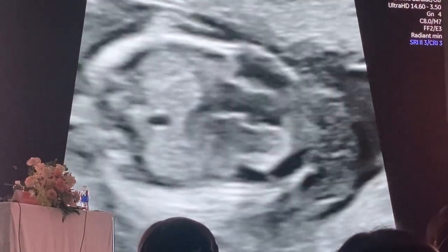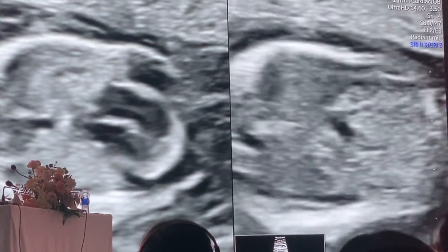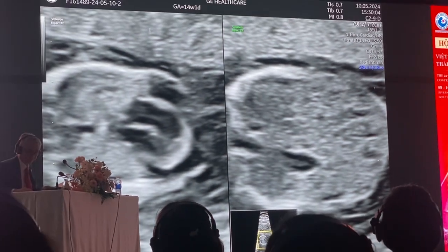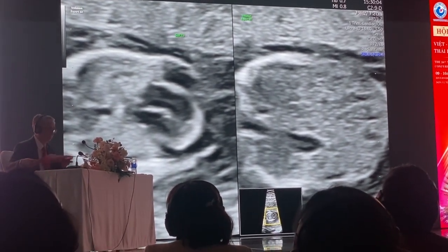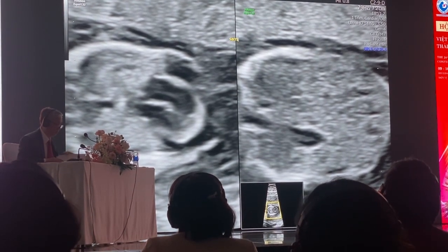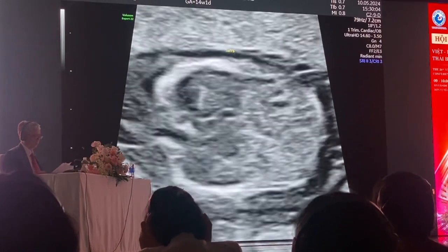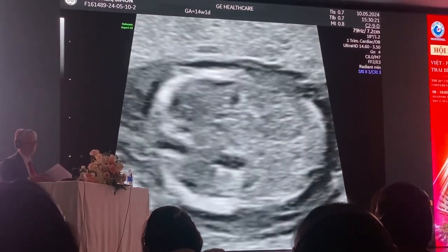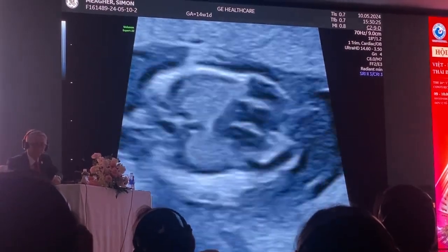And I look at the size of the left and the right cardiac ventricle. And I split the image in 2. I confirm that the stomach is on the left-hand side, and now I do size, axis, rate, rhythm, and situs. So I do SARS. So I then save that image to the screen, and then go back to a 4-chamber view. And once I'm in this, I'm going to go to the sub-menu, and I'm going to take a still image. And then I'm going to come back to my 4-chamber view of the heart.